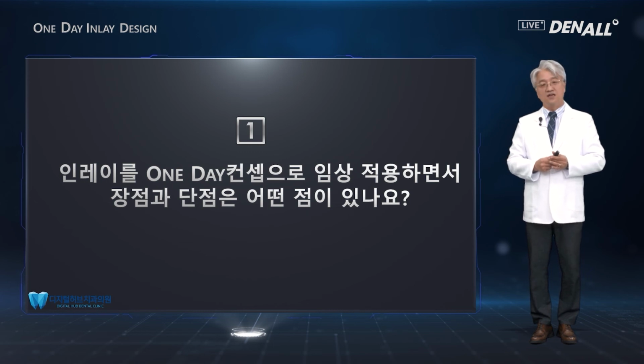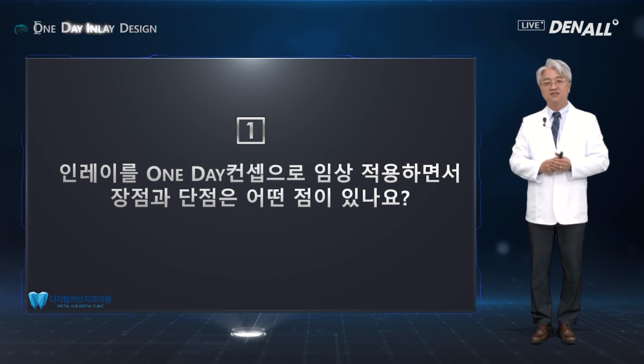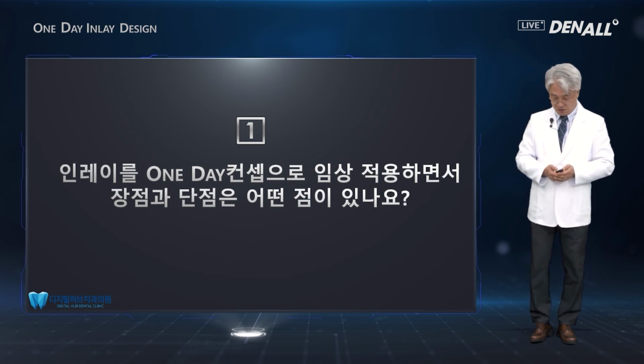But I believe that if you seek support of the digital dental lab, then you need only an oral scanner at your clinic to do the one-day inlay approach. So there are much more advantages than disadvantages in the one-day concept.